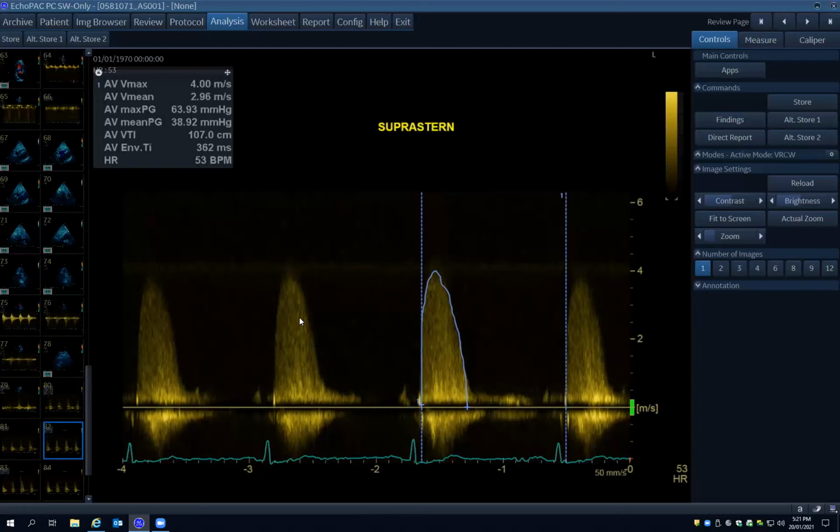And it's relevant in the critical care space, because this is not a moderate aortic stenosis. This is going to have an impact on fluid resuscitation, on inotropes, on why a patient may in fact be hypotensive, and what therapeutic tools you have available at your disposal. So a suprasternal view, which completely changes management. And even in general practice in cardiology, it's not always common to do all the views, though we should be doing it. So I think this is a great illustration.